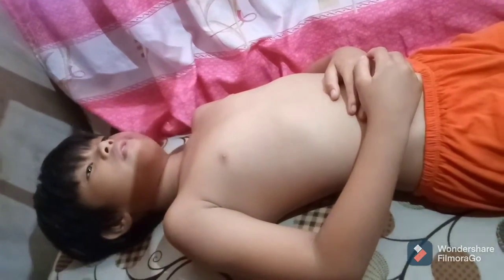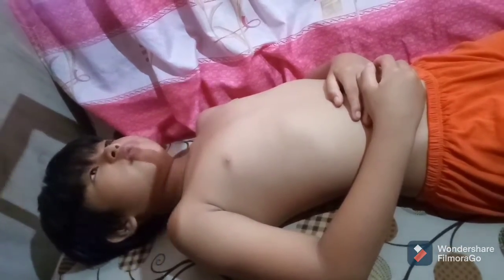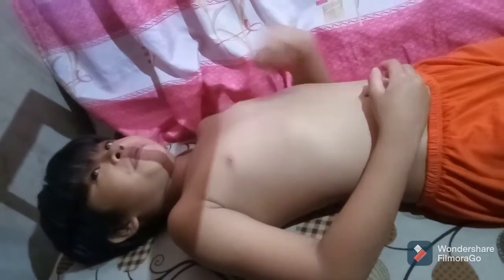The next procedure that we are going to demonstrate is the lateral skull position. The clinical indications for this procedure are the same as shown in the AP projections, such as the AP projection of the skull, the AP reverse Caldwell, and the AP Towne projection. The technical factors: the minimum SID will be 40 inches, or 102 centimeters.